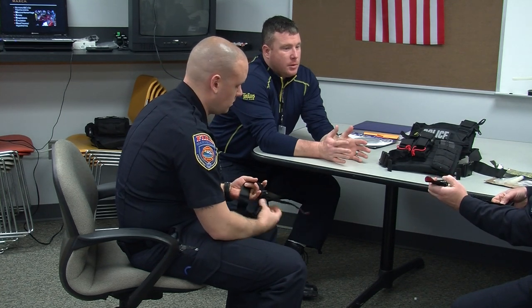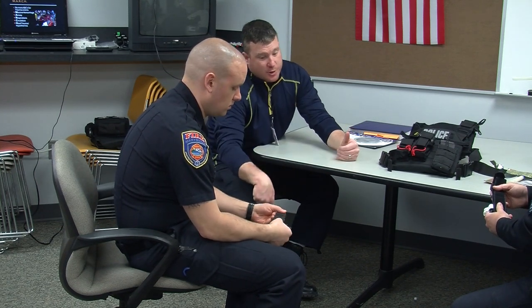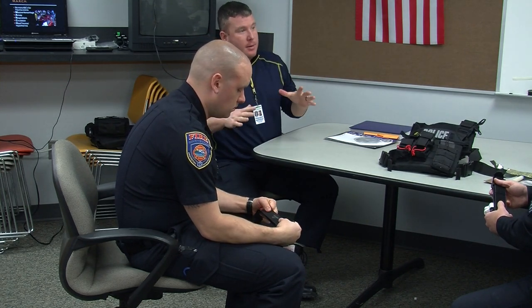So if need be. Now, the only difference is with these, always, and I'm hoping that guys will consciously, once issued these, carry them on duty. If you find yourself in a situation where you're going to apply a tourniquet to an officer that's down, use his tourniquet. Does that make sense? Like, if you know, just routine patrol thing, somebody takes one, and you see the need to apply a tourniquet to them, use the tourniquet out of their cargo pocket and put it on them. That way, you still have one for yourself if you need it. You're always going to try and carry yours. Use their stuff on them.